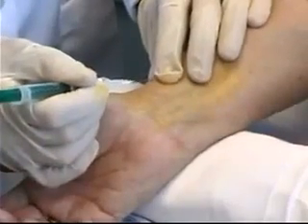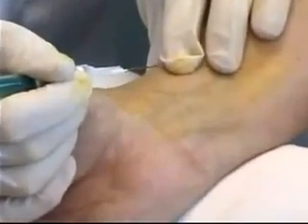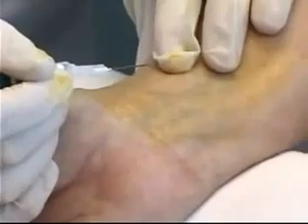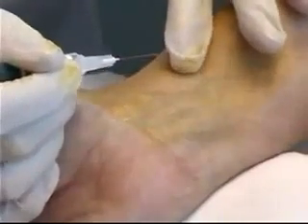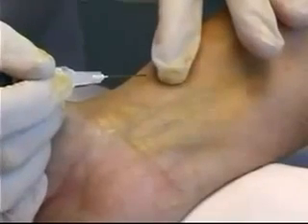I've got my needle right there just ready to go in when I'm confident that I'm in the right area. The last thing I do before I go through the skin with that needle is I'm just going to roll my finger back a little bit out of the way, and now I can put the needle into the skin.